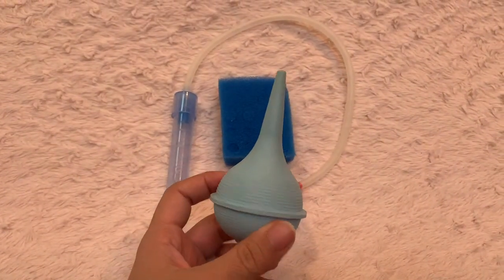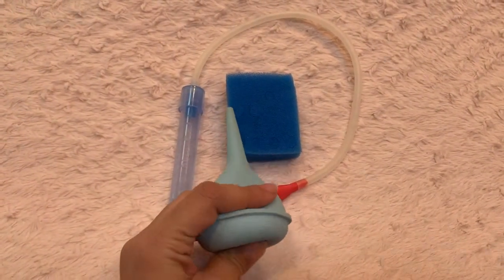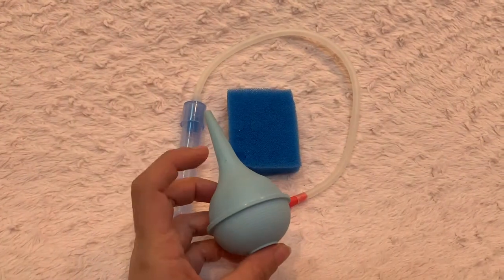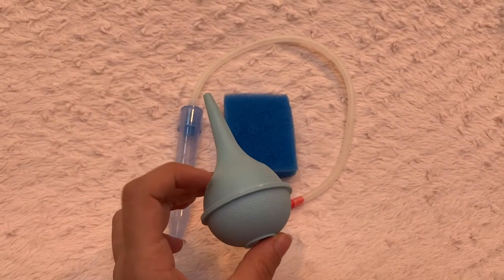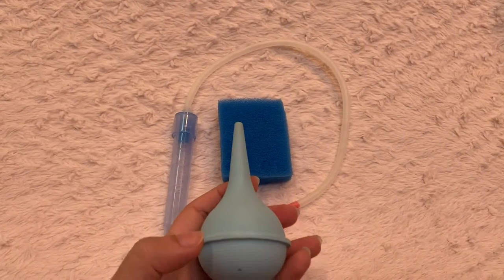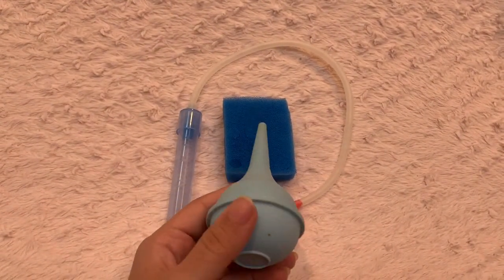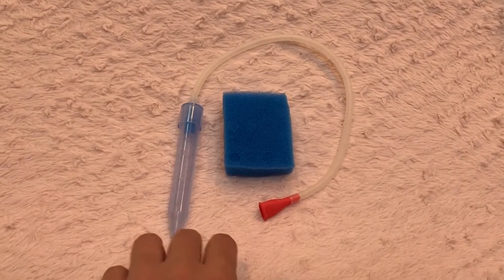This other one is the kind they usually give you in the hospital, and in my opinion this is a much quicker way to suck out the baby's snot. Right now if I have to choose, I usually use this one because it does the job much faster. The negative thing about it though is you cannot clean the inside completely and you can't see if it's moldy. With the NoseFrida, because it's clear, you can see whether you've completely cleaned it or not — and that's a really positive thing about the NoseFrida.